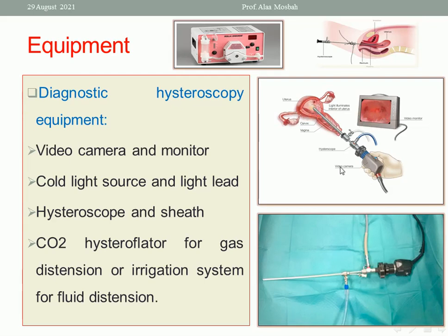Okay, and this is the light source fixed to the telescope to allow illumination of the cavity, and the picture of the cavity can be seen on the monitor by the gynecologist and his assistant.